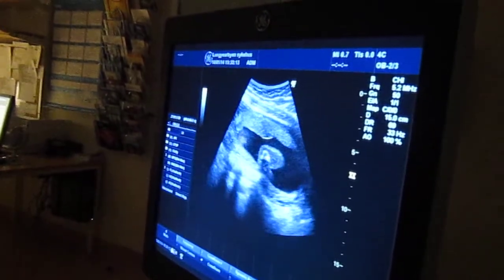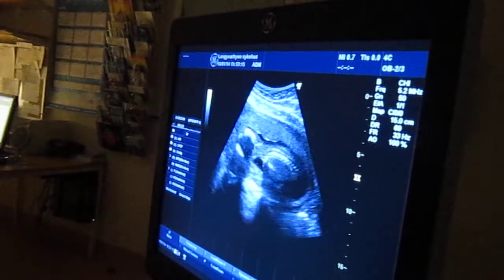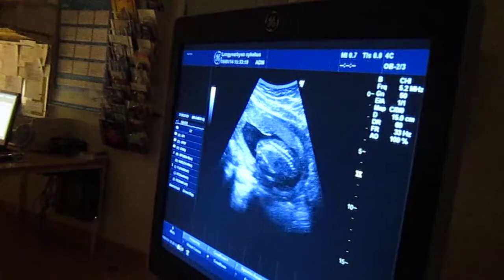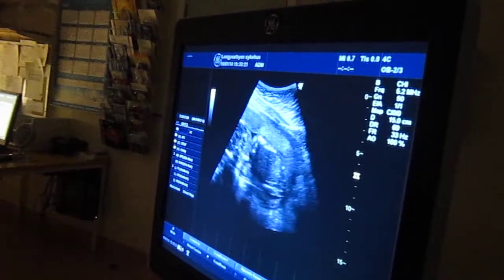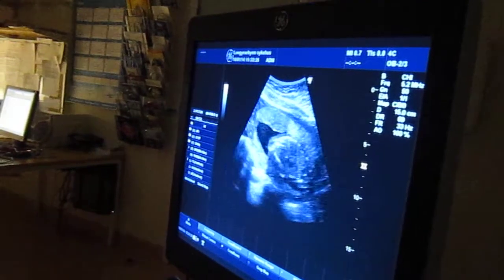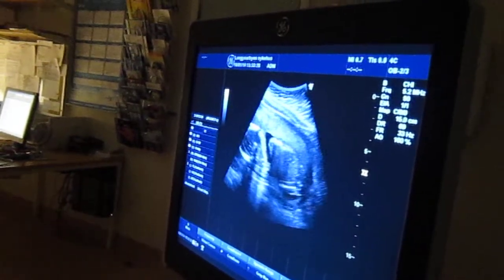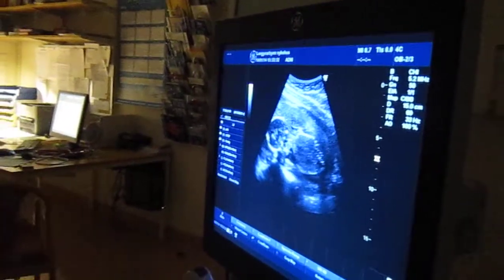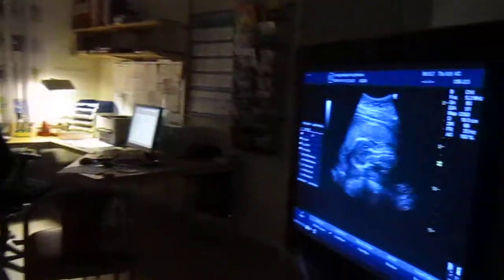And now we're going to take some measurements, and after that we take a look at different organs to see that it seems to be normal, that there are no obvious anomalies, okay? But still you never have any guarantee for that, because if you really should do a very specific ultrasound, we had to have a big, very good ultrasound, and there was a suspicion of something. But we're going to take a look through that baby and see what we find.